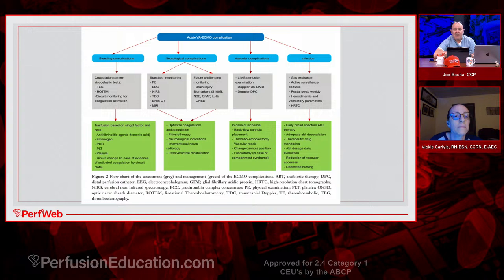You know, we always seem to push the envelope a little bit, and we're taking on much more challenging cases with a much higher predicted mortality. And we're taking everything we learned from here and translating it over to there. We're seeing improvement in outcomes with patients who before we might not even consider for ECMO. I think ECMO usage will continue to grow and expand, and the criteria for ECMO will also expand.